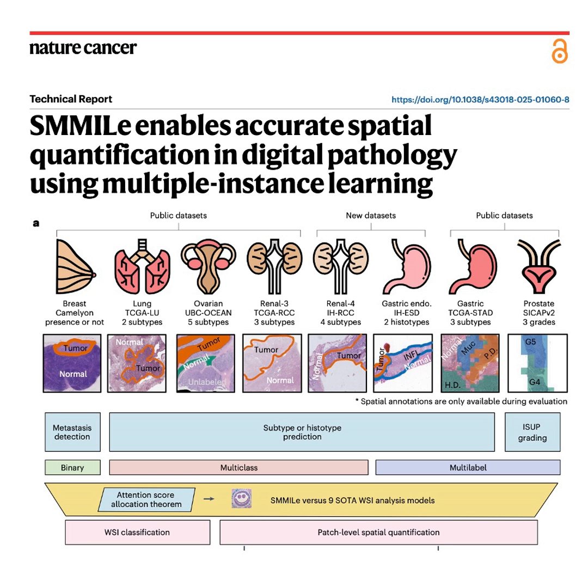Even with Conch, SMMILe still outperforms the top 4 competing models by 5 to 20% in spatial F1 scores. Wow. Why is that? Because the other models still struggle with recall. The foundation model makes them very precise. They don't flag healthy tissue as cancer anymore, but they still suffer from misdetections.